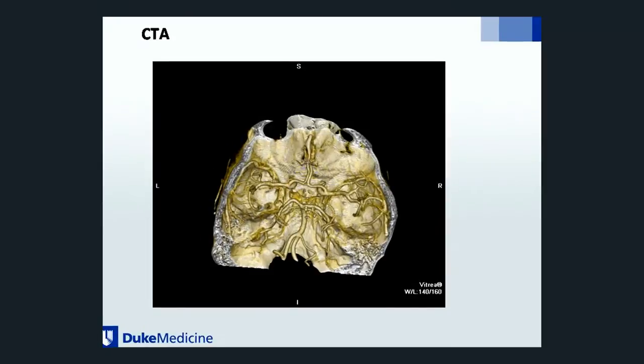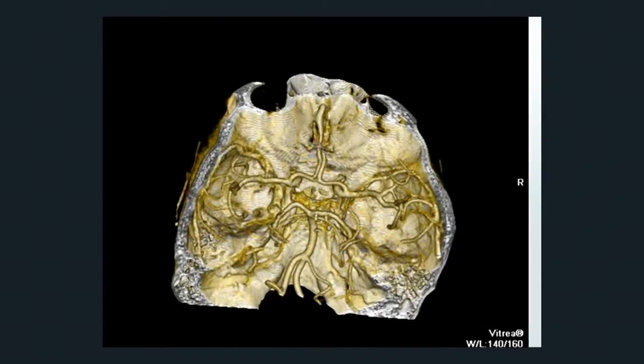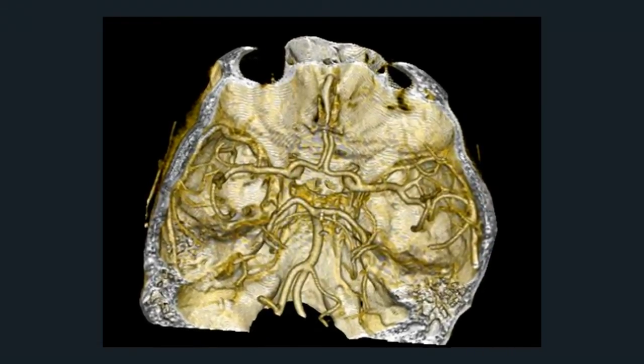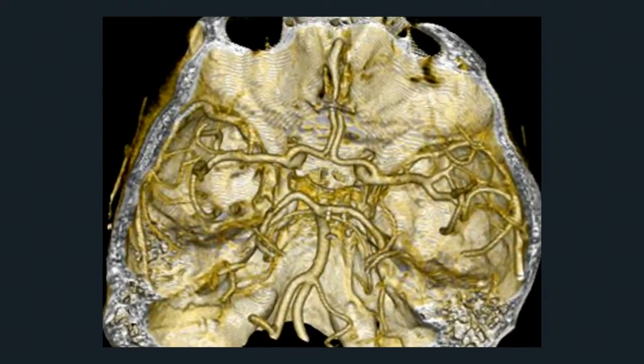One of the ways is the CT angiogram. These are the images that I showed you earlier. The nice thing about a CT angiogram is it gives you a beautiful, very sensitive, and high fidelity reconstruction of the blood vessels, and in three dimensions, if you so choose, to see them. You can see the contours of the blood vessels are very well represented, the connections of the blood vessels are well represented, and the relationship of the blood vessels to the bone is well represented. So you can plan how you're going to treat an aneurysm if you see one on this modality.